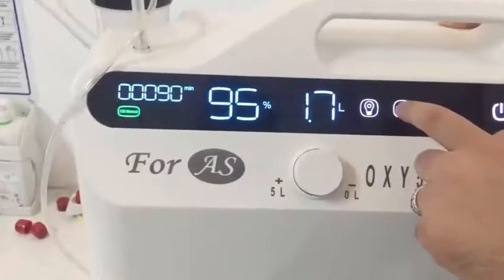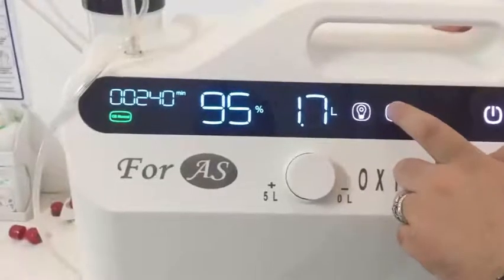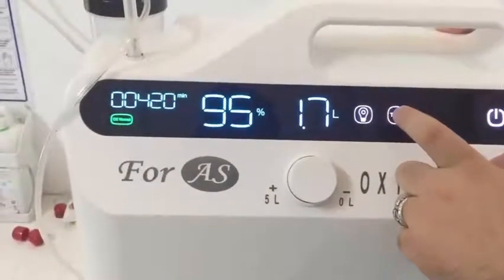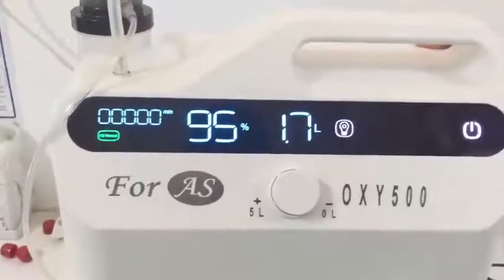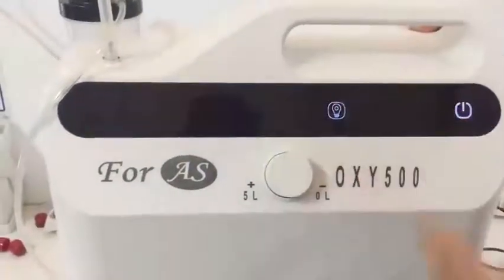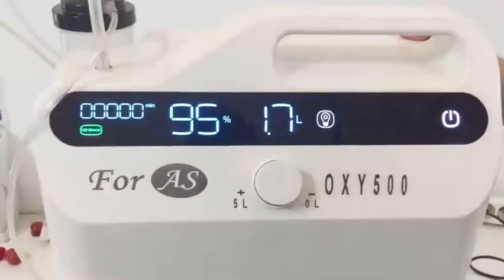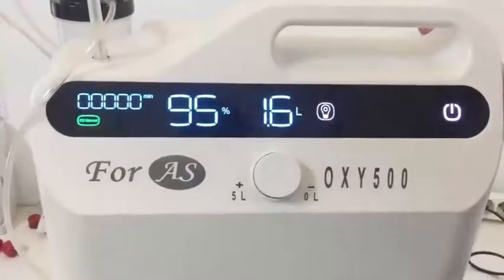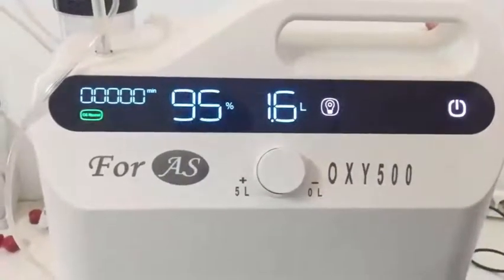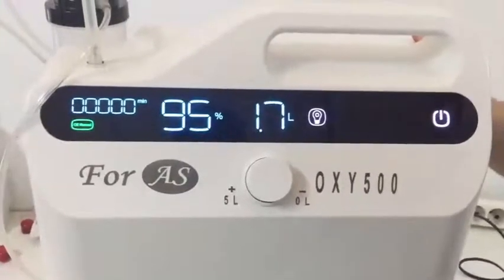Regarding maintenance, there are filters to be changed in the device. Before changing the filters, be sure the device is in the off position and the power button at the back is turned off, and that the device is unplugged. The filter visible in this part is a washable filter — you must wash it every three to four days with warm water and dry it. You may not use any detergent on this filter.